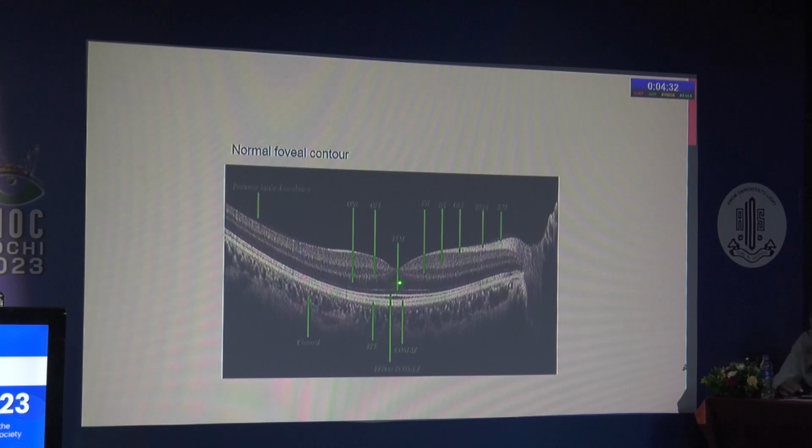It's because the cones are very thick here, so there is a vacuum in between. It's not that the cones are not attached to the RPE at this stage, but there is a gap, because the light wave will only catch when there is obstruction. So this is a vacuum area, so it's just lifting up because of the high cone heights in this area.